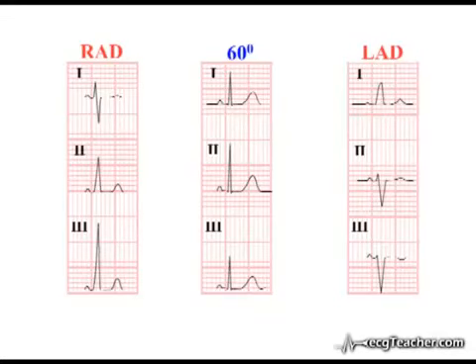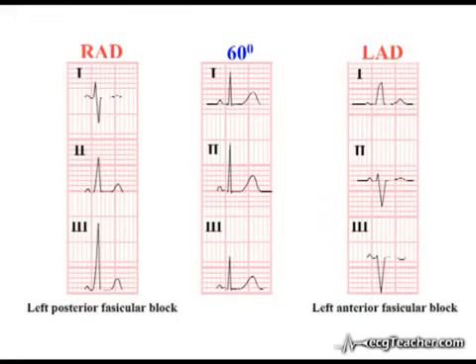Keep in mind that damage to the distal branches of the left bundle branch, the commonest cause of axis deviation, results in a slight delay in depolarization of the affected region of myocardium. For this reason, in axis deviation, the QRS duration tends to be in the upper limit of the normal range, between 0.1 and 0.12 seconds, and positive and negative components of the QRS complex in the individual leads separate to some degree.